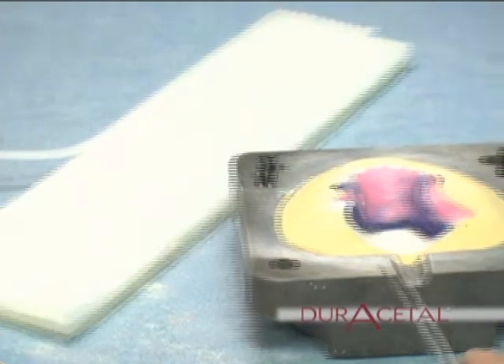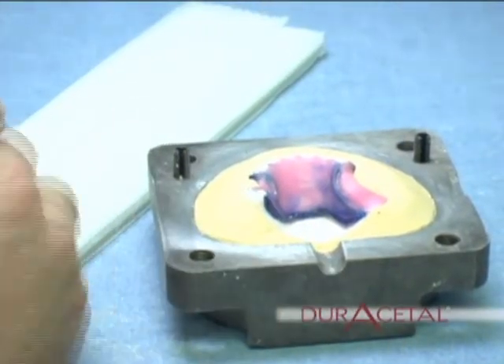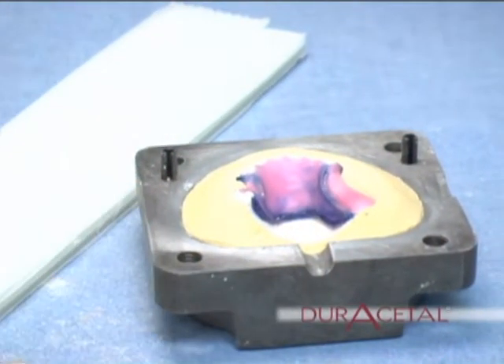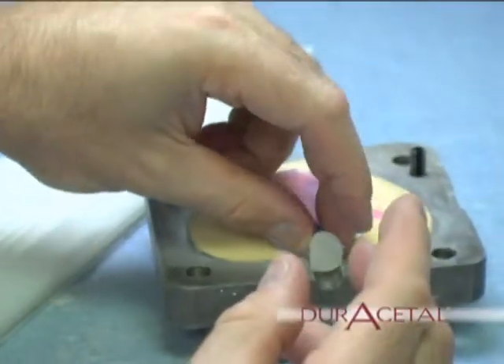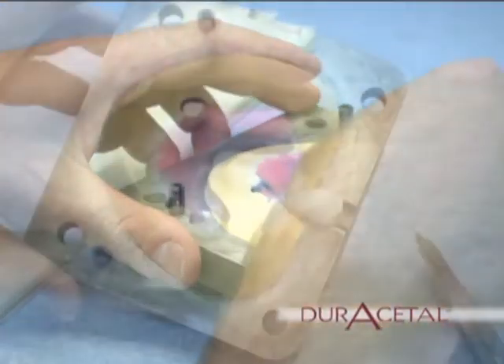Spruing. First, a bullet-shaped piece of wax is created and placed in the channel on the flask. With hot wax, seal it in place.